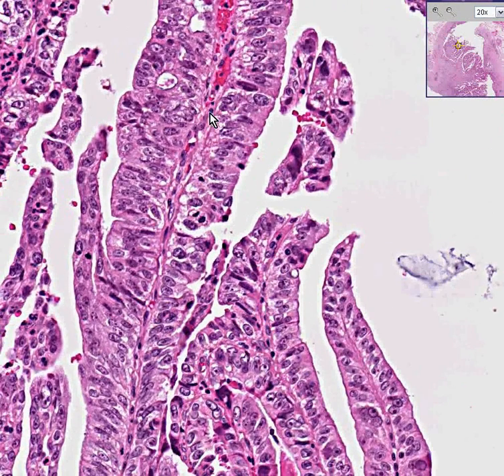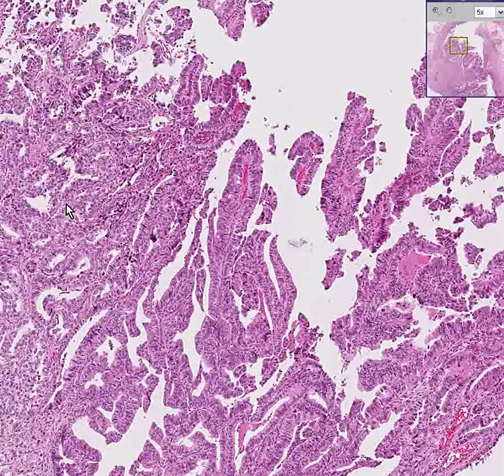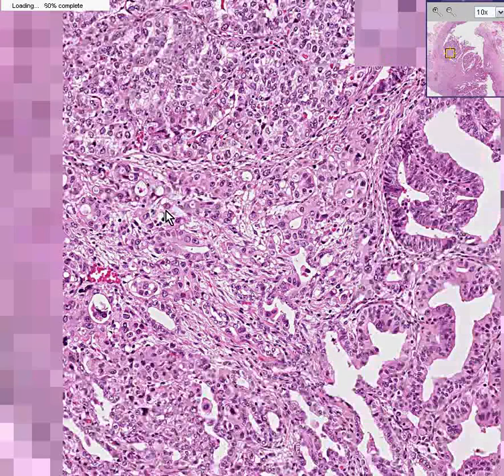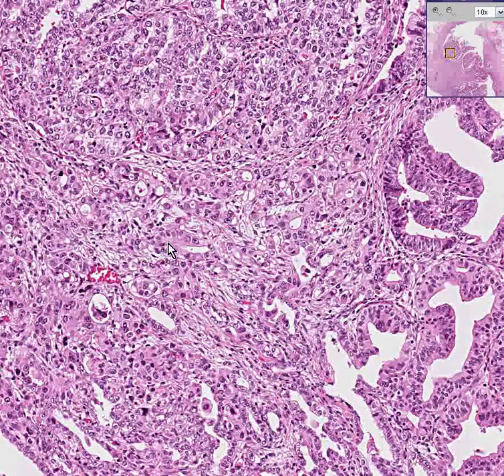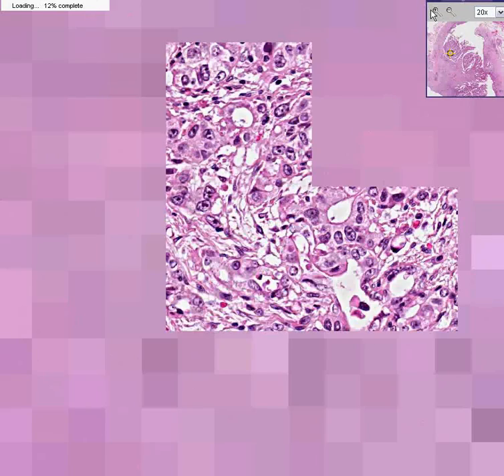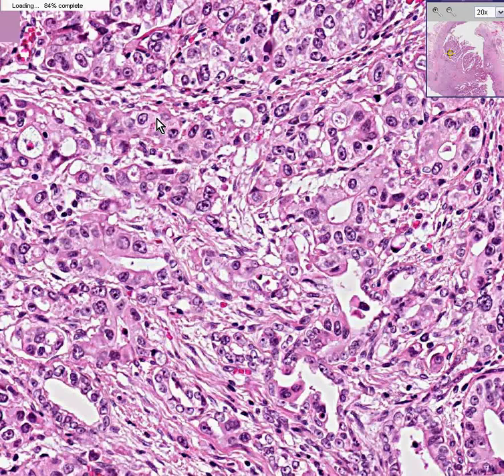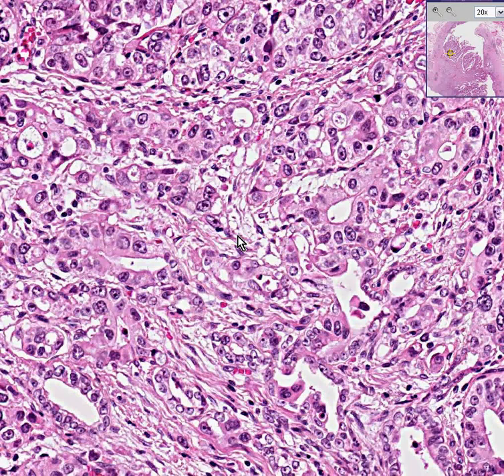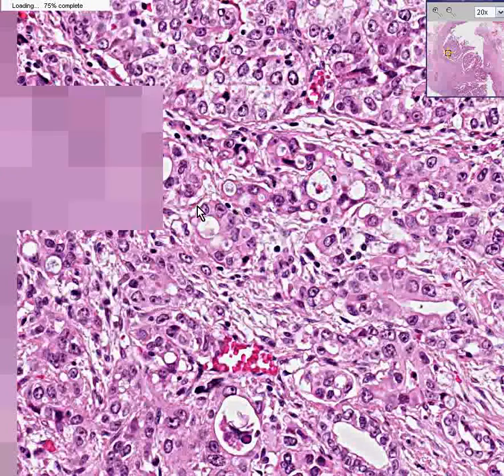Notice how in this area they still seem to be pretty well delineated from the central fibrovascular core of the papilla. But also notice that somewhere along the line, they sort of lose their papillosity and turn into a pattern that looks kind of diffusely infiltrative of the connective tissue or stroma between it. And in this area, although you could probably call this a gland, in many areas it kind of loses its glandularity. In some areas like here, you might have a hard time trying to figure out which was an actual tumor cell and which was a normal connective tissue cell.